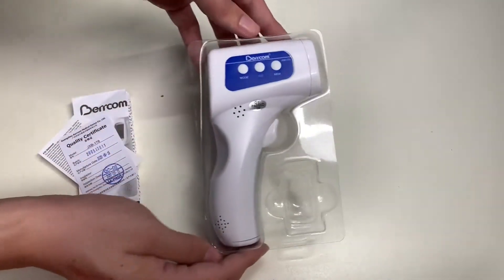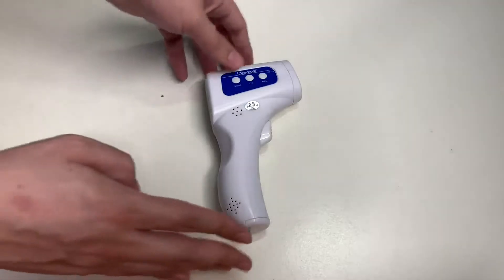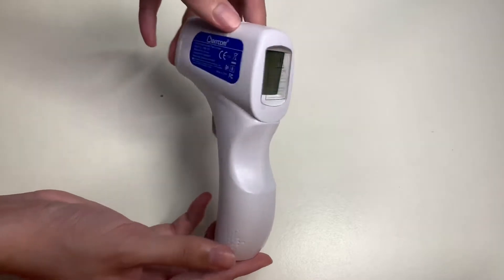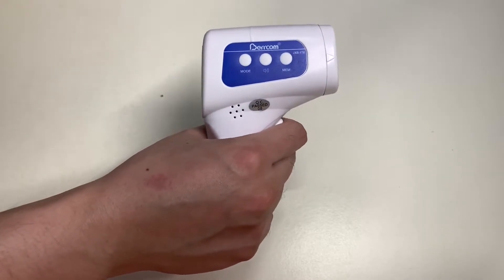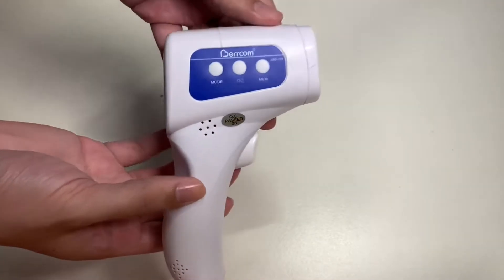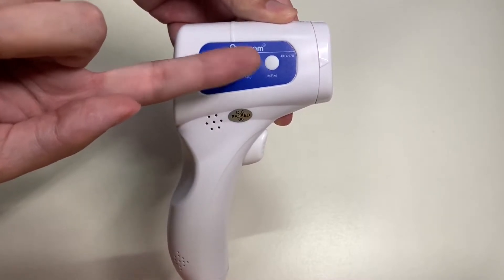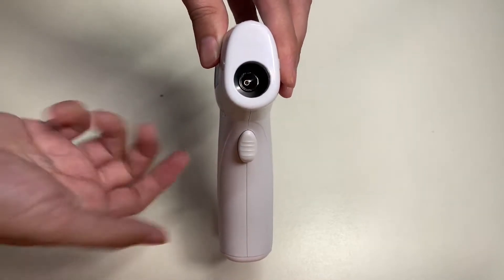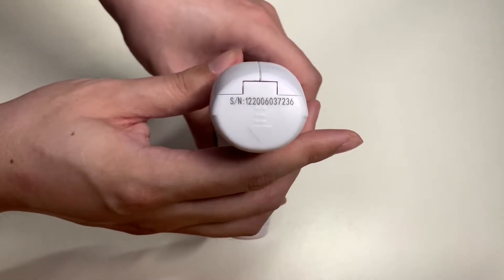Now here's the most important part of the video — the thermometer itself. Here's the display and the back side of the thermometer along with the sensor. All you have to do is pull the trigger to activate the sensor. Here are the three buttons: the mode button, the sound button, and the memory button that holds up to 32 readings. Here's the sensor that shoots out infrared, the trigger, and the bottom where you put the batteries, which are already included.